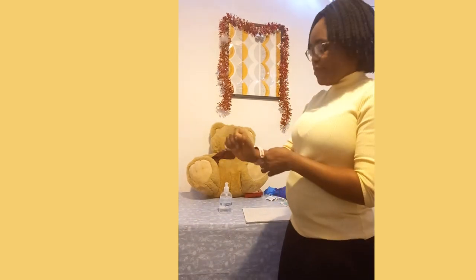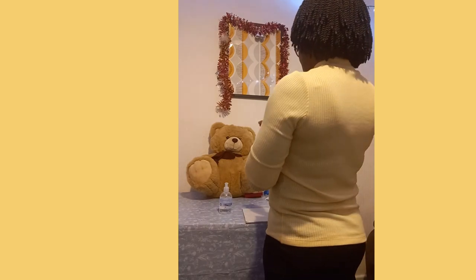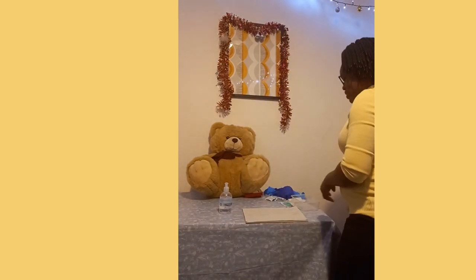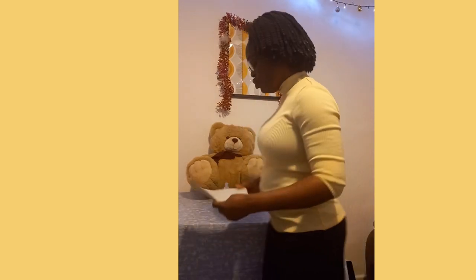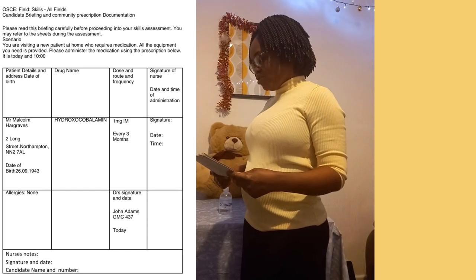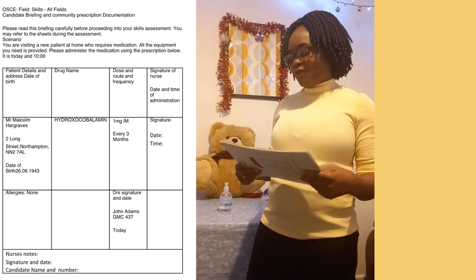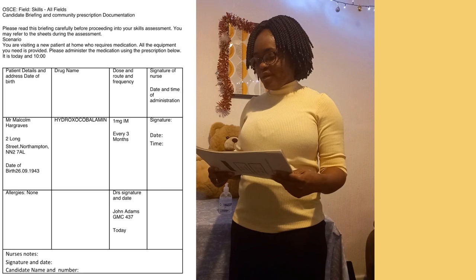I wait for my hands to dry for 30 seconds, then I approach my patient. Hello, my name is Bosse. I'm one of the community nurses here today to come and administer to you your due intramuscular injection. Can you please confirm to me your full name and your date of birth so I can cross-check with what I have on my documents?